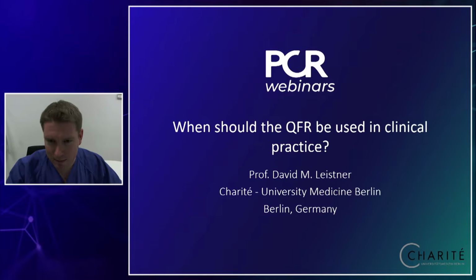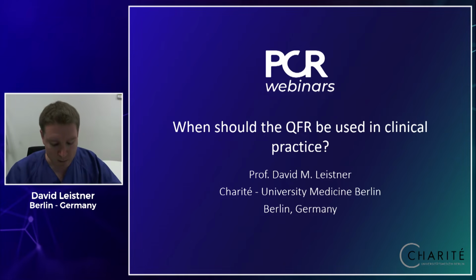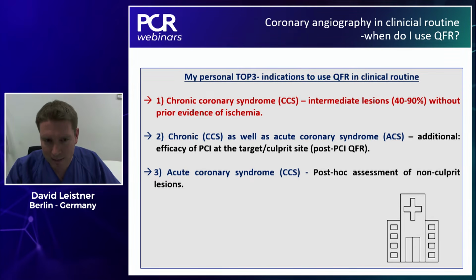I really like to talk with you about QFR this evening, since I'm 100% convinced that QFR is a very important step forward to achieve the goal of precision medicine in the interventional treatment of coronary artery disease. And therefore, I'm very happy to share with you some thoughts about the question, when should we use QFR in clinical practice? When you asked me to talk about this topic, I remembered what are my personal top 3 indications where I use QFR in clinical routine.